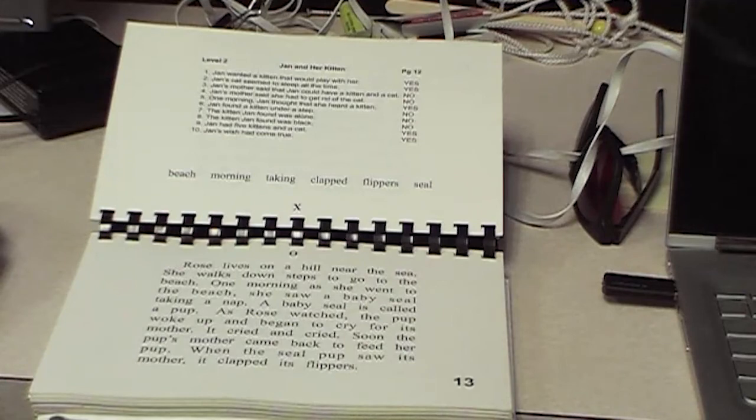So what we're doing here is we're measuring how somebody moves their eyes from left to right, how they fixate, how they regress, meaning how much they move their eyes back. But more importantly, it tells us about how many words per minute this individual is reading and what their comprehension level is. Here, Dr. Tiomno is demonstrating how these special ReadAlyzer goggles are worn.